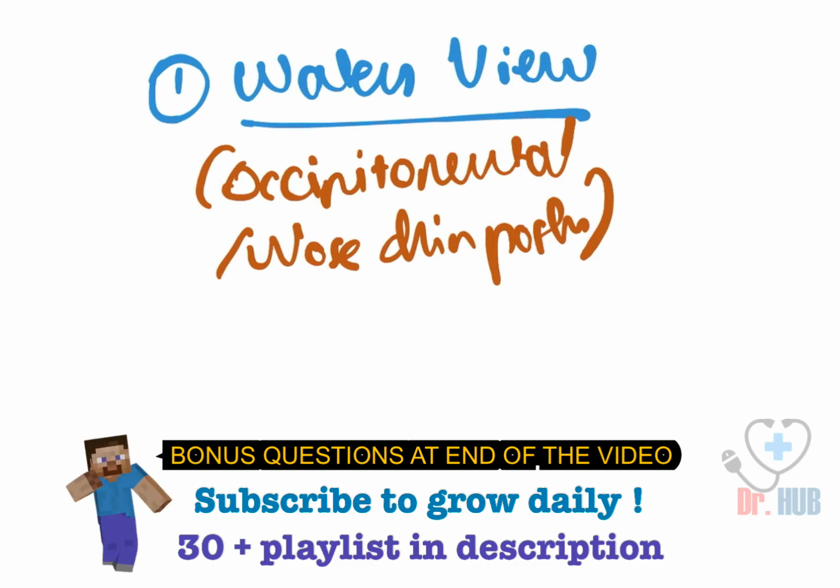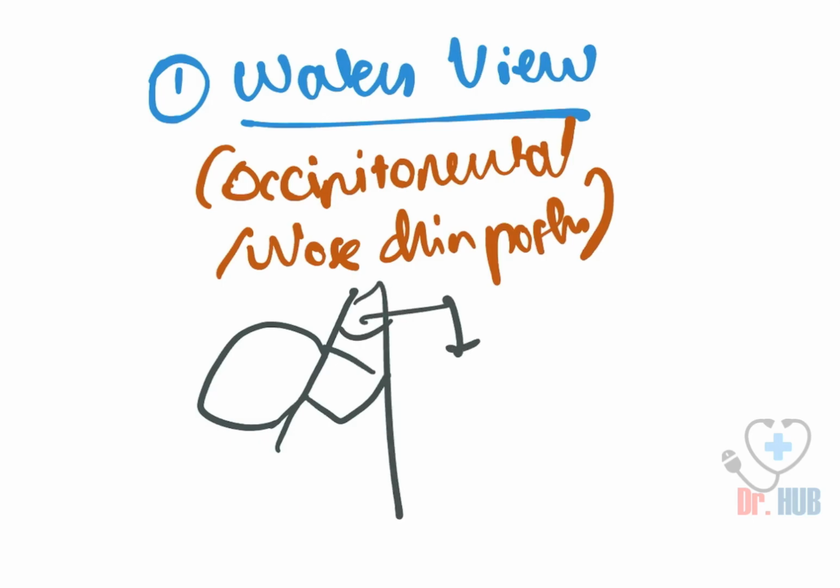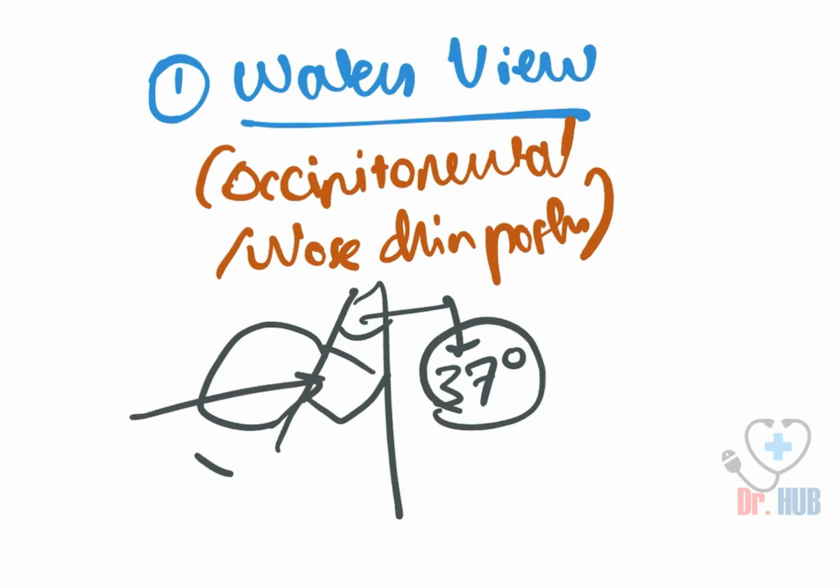And here the skull appears like this. There is an angle, this angle is 37 degrees, and the X-ray beam is from this direction.